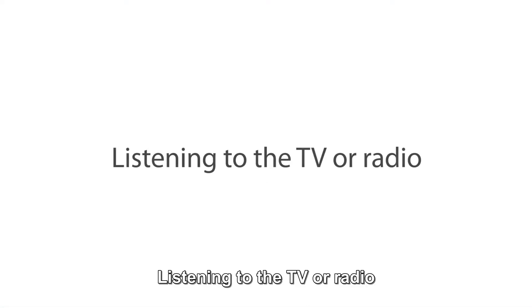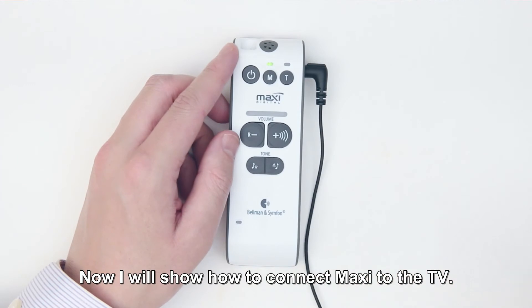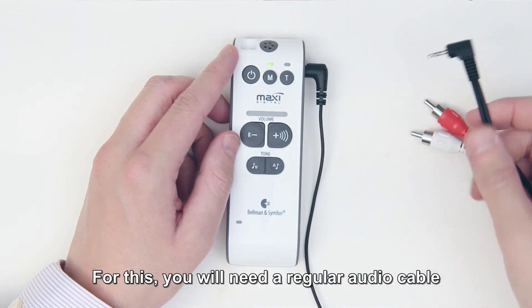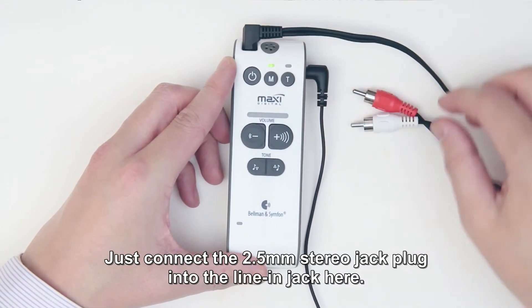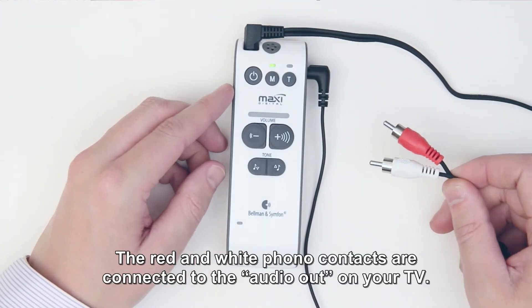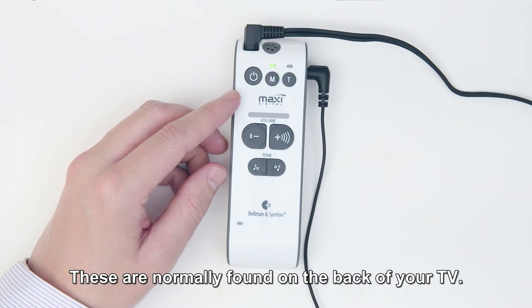Listening to the TV or radio. Now I will show how to connect Maxi to the TV. For this, you will need a regular audio cable, which can be purchased separately. Just connect the 2.5mm stereo jack plug into the line-in jack here. The red and white phono contacts are connected to the audio out on your TV. These are normally found on the back of your TV.